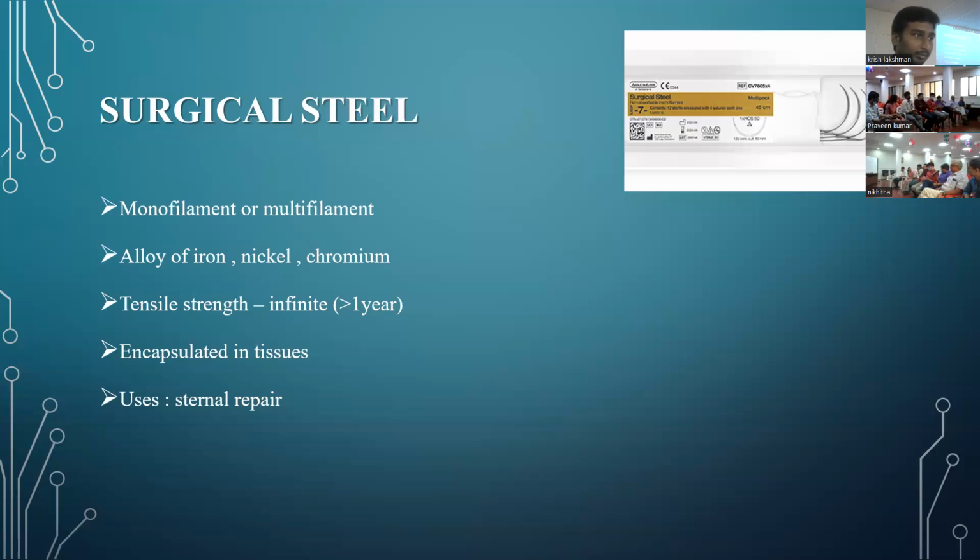Steel is not a problem. Stainless steel wire is so thin that it is flexible.